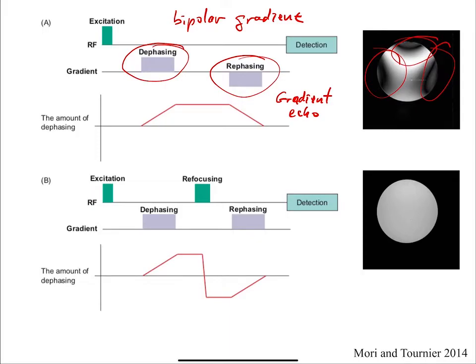So what we can do is use a spin echo. We have this refocusing pulse, which gets rid of those inhomogeneities, such that the dropouts that are due to the static inhomogeneities go away. The tricky thing is, though, because this refocusing pulse changes the phases, now the bipolar pulse becomes symmetric around the 180. So even though we talk about bipolar gradients quite a bit, when there's a 180, they're actually in the same direction. So that's just something to know.